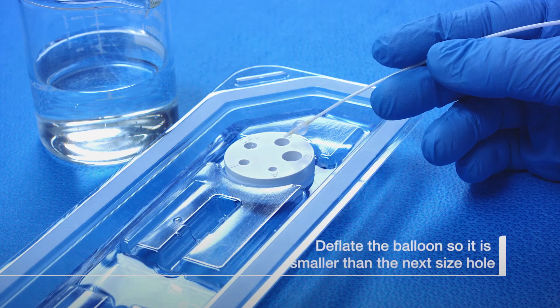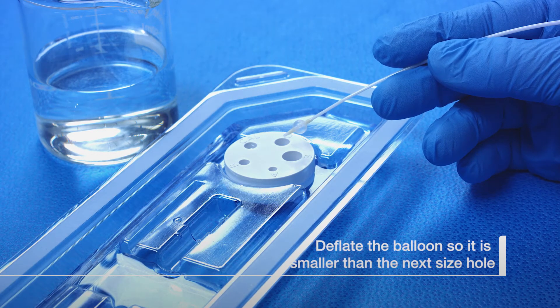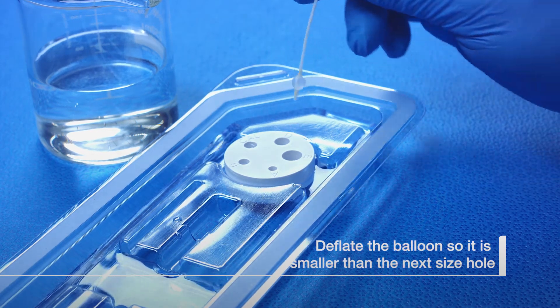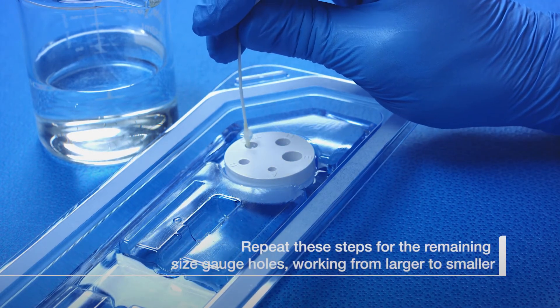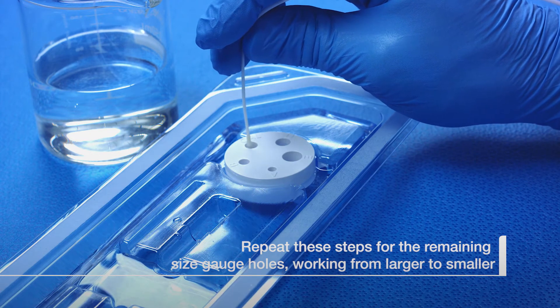Deflate the balloon so it is smaller than the next size hole. Repeat these steps for the remaining sizing gauge holes, working from larger to smaller.